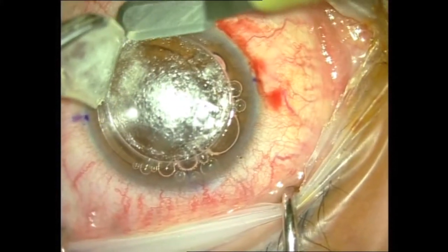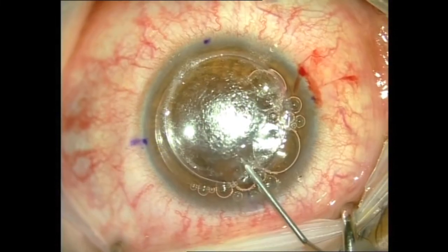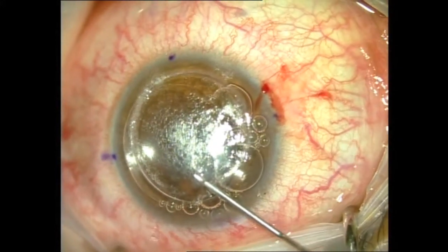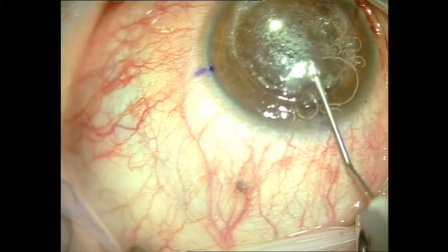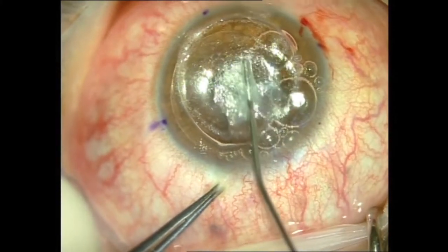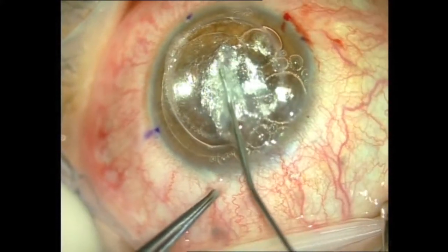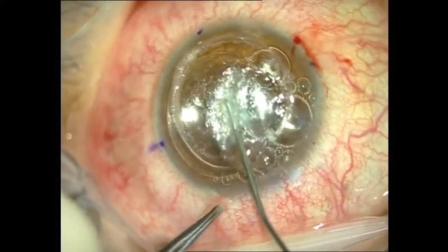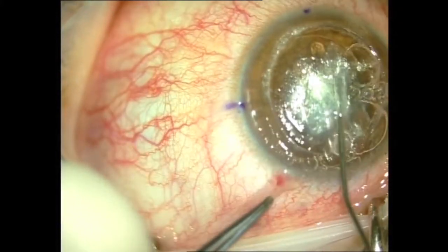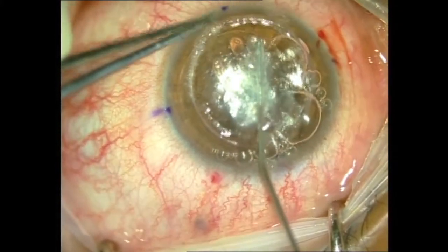Now I am aiming to dissect deeper layers of the stroma as far as possible. I usually use the stromal microbubbles as a guide, performing a tunnel over one of the microbubbles and then introducing the viscoelastic cannula in the tunnel to perform blunt dissection of the stromal layers.